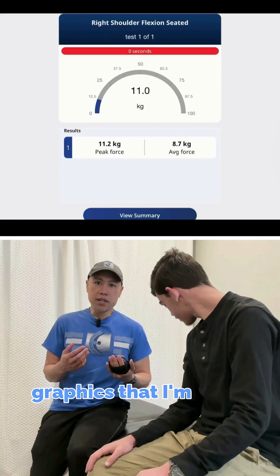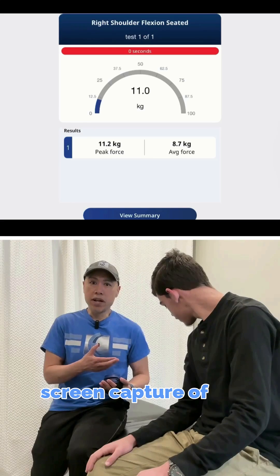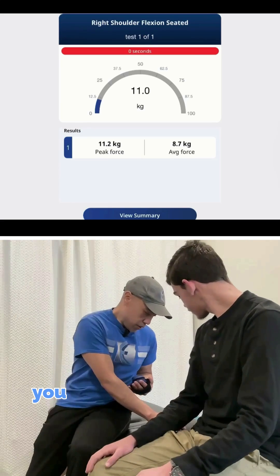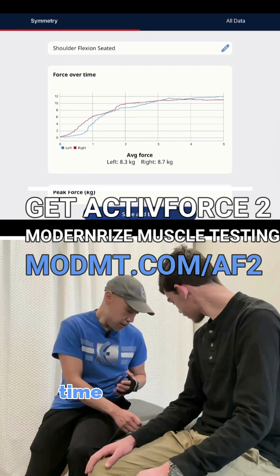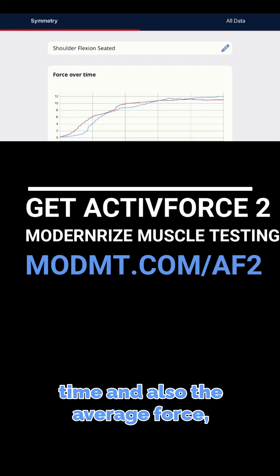So now you can see in the graphics — I'm going to include a screen capture of my iPad — that you can easily view the summary, and it shows peak force over time, and also the average force.